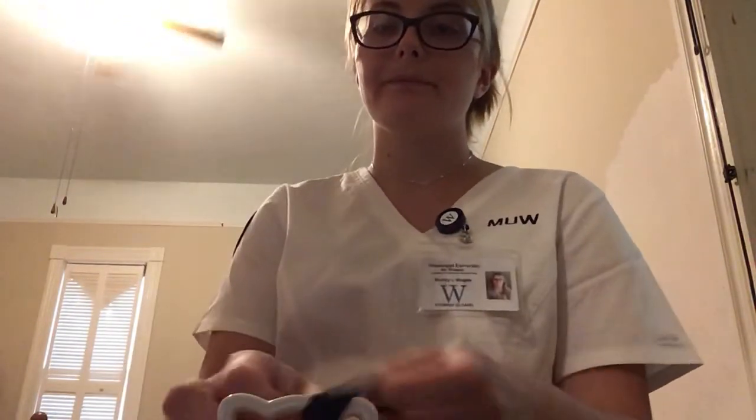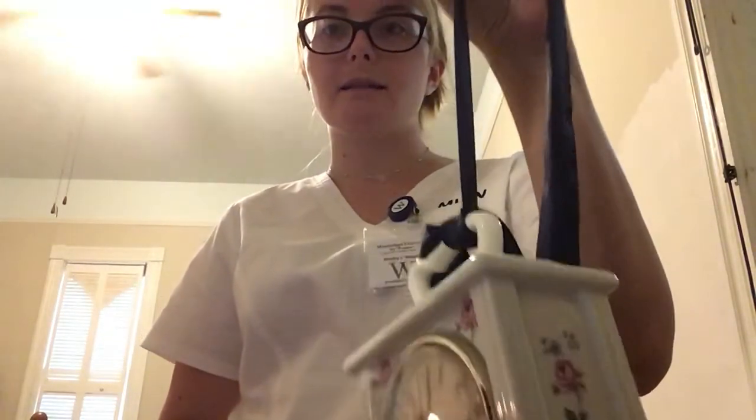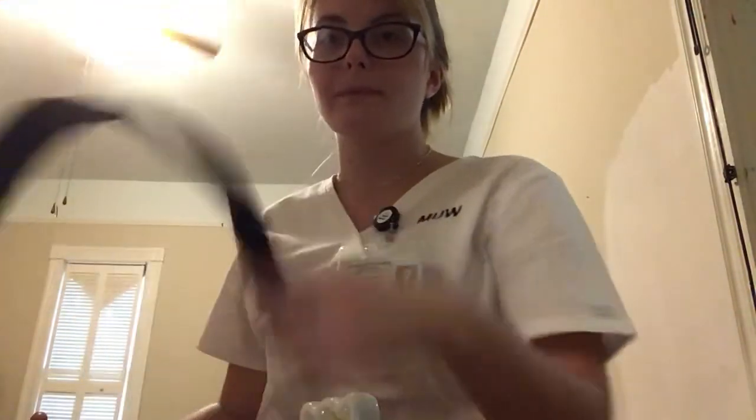We also want to make sure that we come back and we check on the patient often, but also we should remove the restraints every 2 hours and assess whether the patient still needs it, or the skin integrity and things like that. So now I'm going to demonstrate how to tie a slip knot for a restraint. So this is tight, it's not going anywhere, and then I can just pull here and it goes right through.